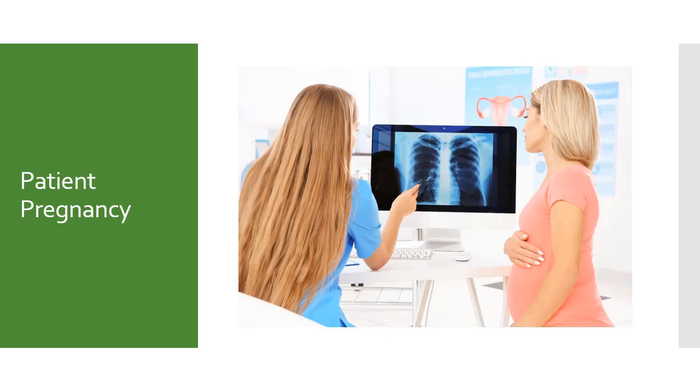For non-urgent procedures, it is possible to have a policy of elective scheduling, which means that the X-ray can be scheduled within 10 days of the onset of their last menstrual cycle in order to avoid the possibility of pregnancy. There are new standards that are coming out, and there are some facilities who do not shield pregnant patients, and we will talk about that towards the end of this presentation.